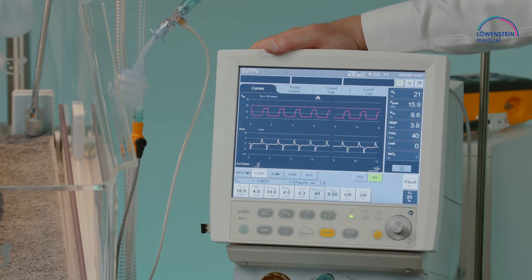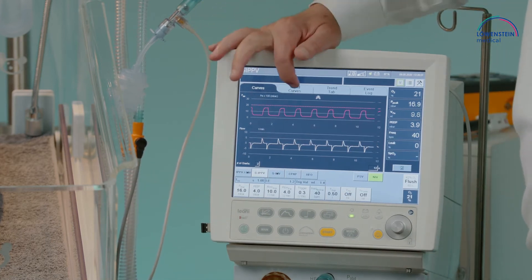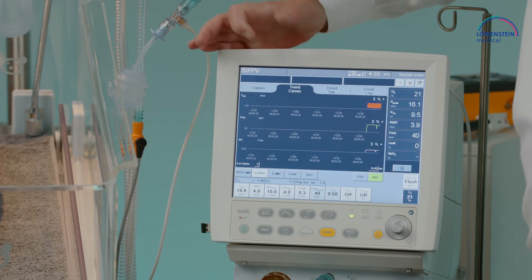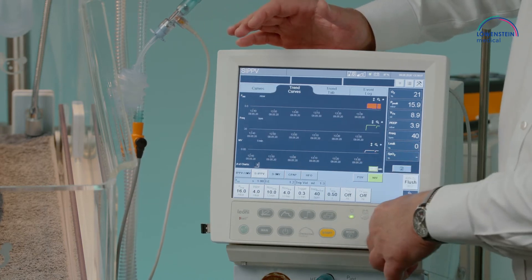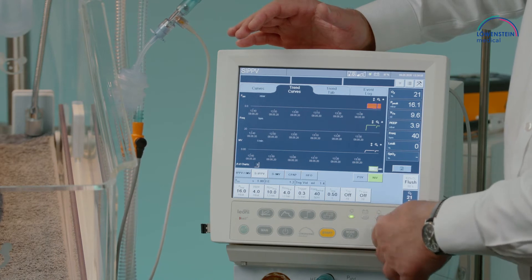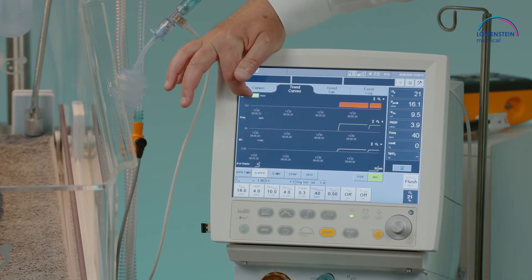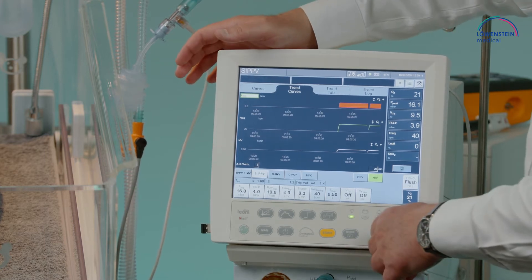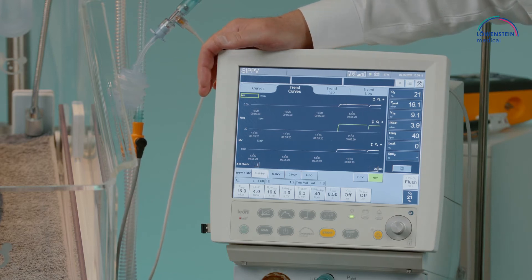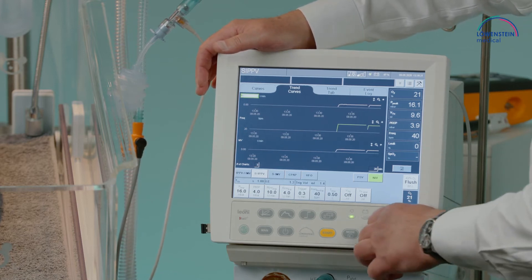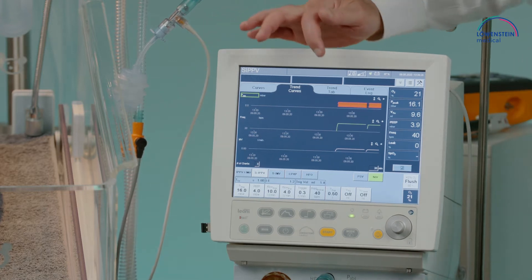We have directly the graphical user interface with curves, and a trending opportunity where the time can also be adjusted. We have free access to choose what we want to display — for example, the minute volume or other parameters as a continuous graphical trending.